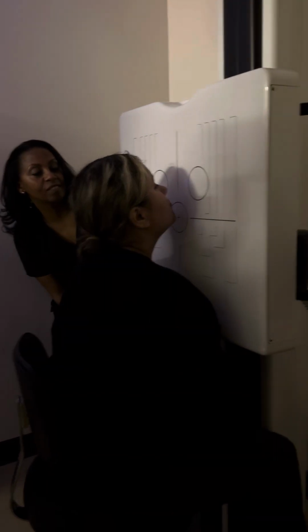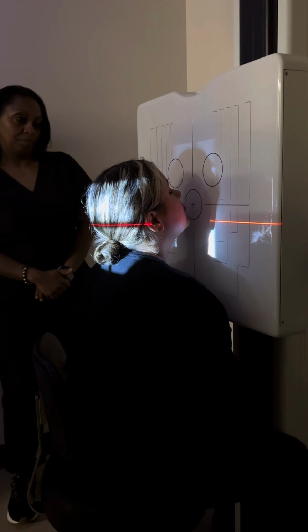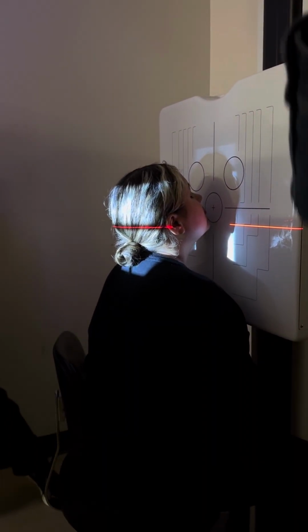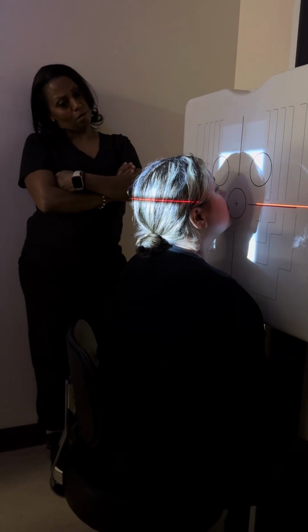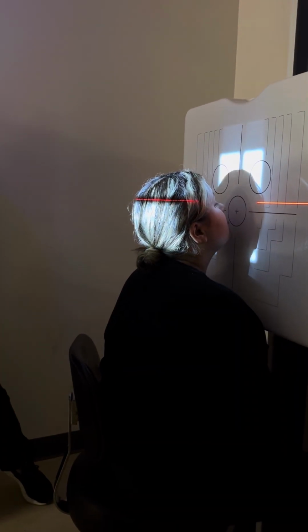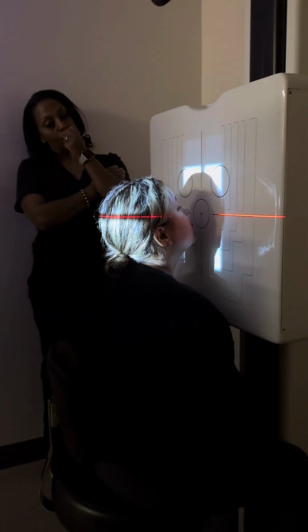But in fact, go ahead and turn the light on for me. We exit here, the acanthion. So come up higher with the image receptor. Right above, between the base of the nose and the lip, we exit there. A little higher for me? Not that much. Just slight. Back down again. Just right here. This is called the Waters method.